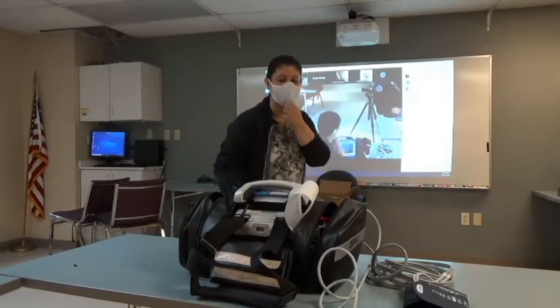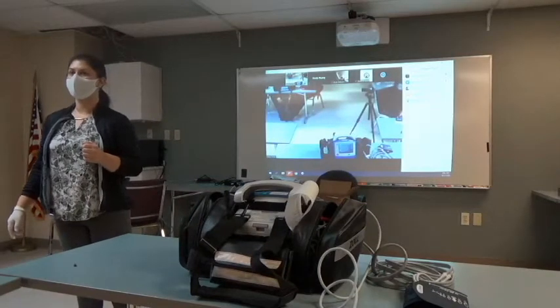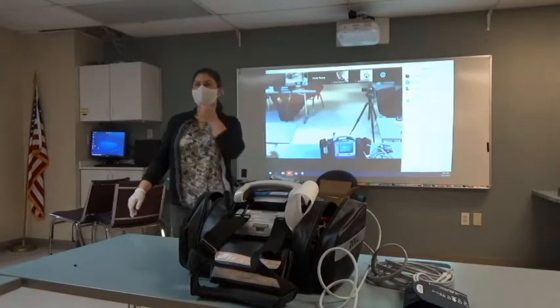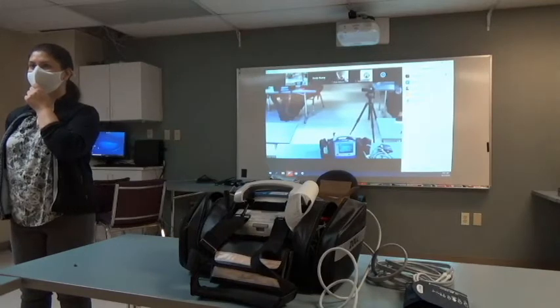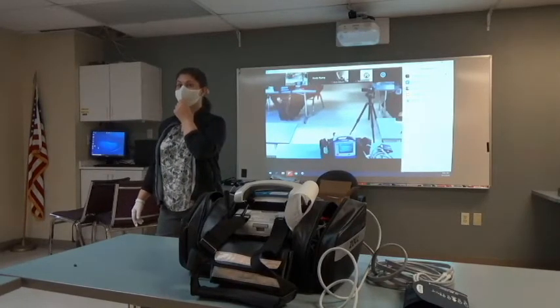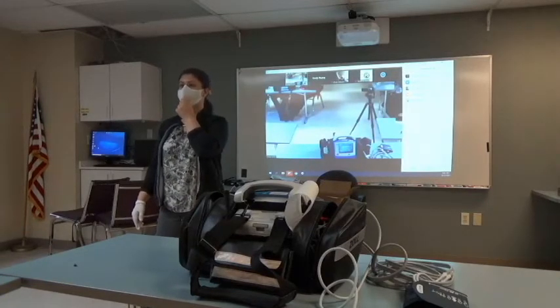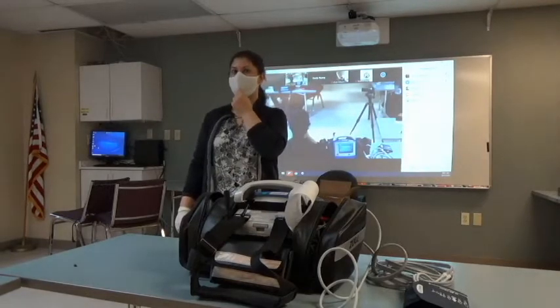Go ahead and press your back arrow key. When you press your back arrow key, you're going to find a button that has a green check mark. That green check mark is all of your archive 12 leads. We hold a total of 32. We get rid of the oldest to make room for the newest. So you could go back and reprint or retransmit if you needed to. Any questions on how to access the archive?